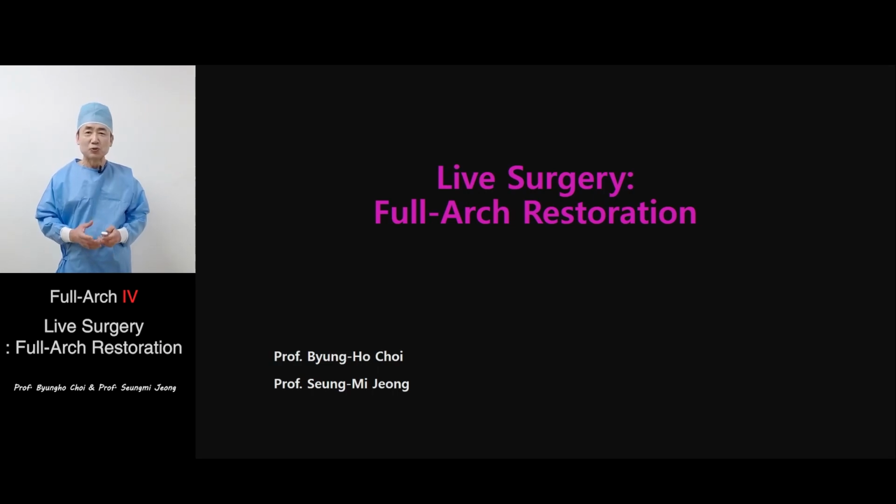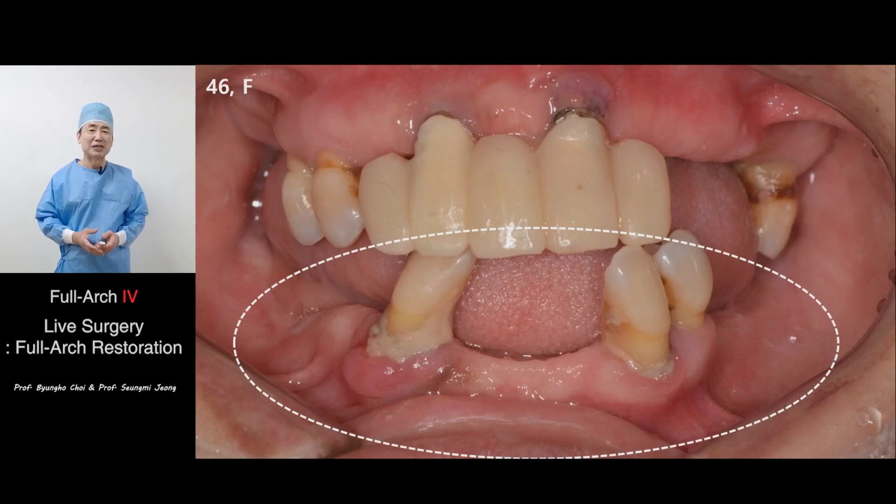Today, you will be watching live surgery, which is about full arch restoration. First, let me introduce the patient for the live surgery. She had many teeth problems in the mouth. First, she wanted to get lower teeth problems fixed.